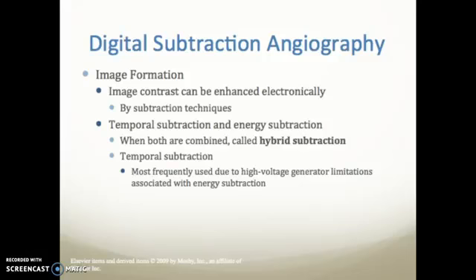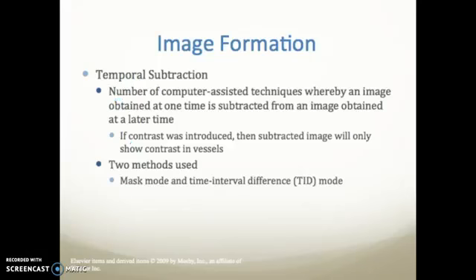So, image formation. Image contrast can be enhanced electronically by subtraction techniques. There's temporal subtraction and energy subtraction. When both are combined, it's called hybrid subtraction. Temporal subtraction is more frequently used due to the high voltage generator limitations associated with energy subtraction.